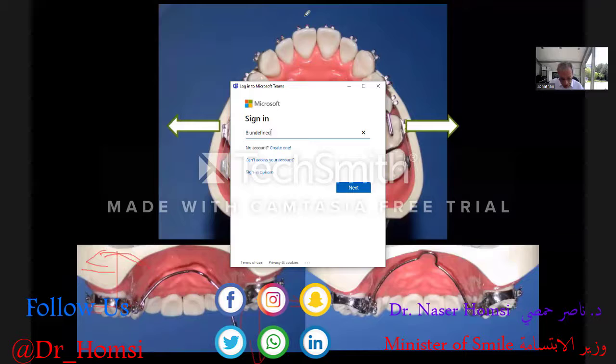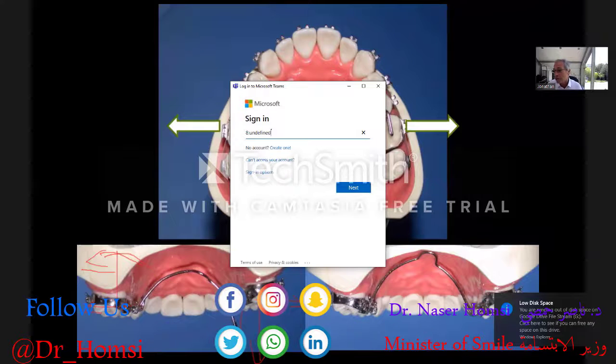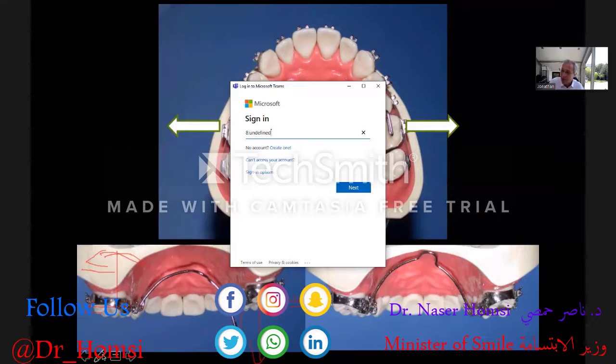Okay. Thank you very much. And somebody else has asked, what dimension of palatal arch do you use? And also, would you consider using a quad helix ever to produce these very same movements? Because of course you would have much more wire in a quad helix than a simple transpalatal arch.